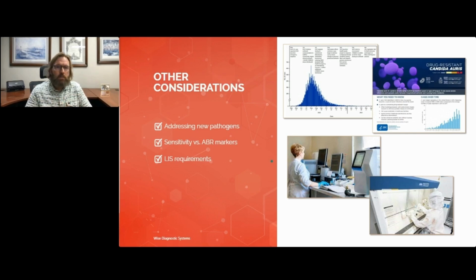Another thing to think about is the sensitivity, the culture and sensitivity. I'm talking about that sensitivity side of it versus the antibiotic resistance markers. One thing that sometimes comes up in discussions is that when a culture and sensitivity is performed, that specific specimen is placed in there with the various antibiotics, and you're finding the sensitivity to that specific pathogen that was grown during the culture. So a little bit different than how the antibiotic resistance markers are tested.